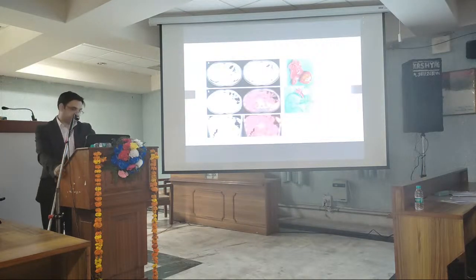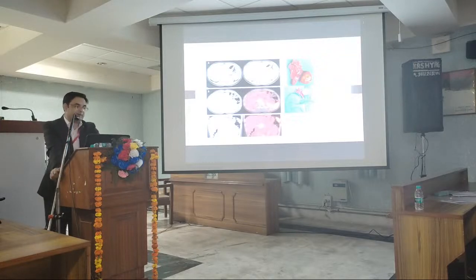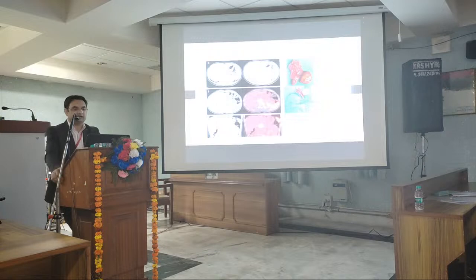Then moving on, we are using gallium pentixafor, or CXCR4 imaging, basically for localization in primary aldosterone producing adenoma. With the help of pentixafor imaging, we are able to differentiate unilateral aldosterone producing adenoma from bilateral idiopathic hyperplasia versus non-functional adenoma.